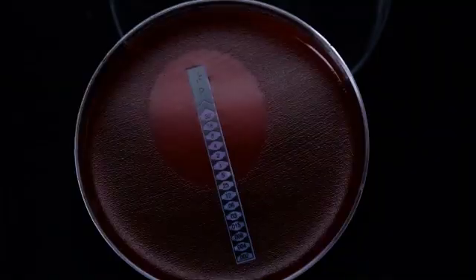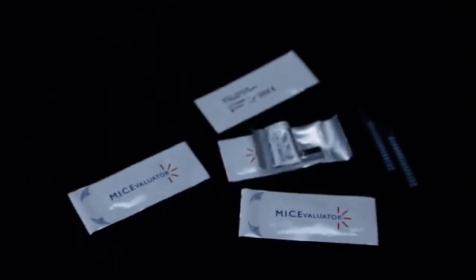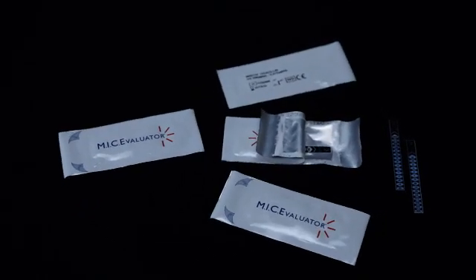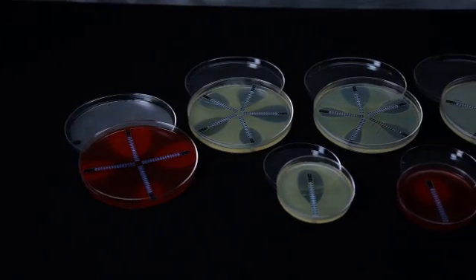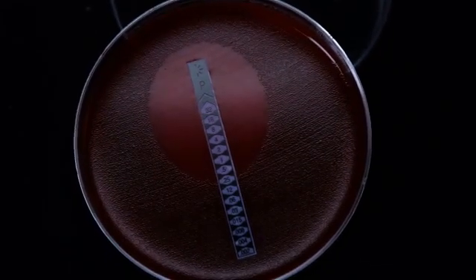After incubation, read the MICs where the growth of the organism touches the strip. If strips are being used for clinical purposes, only the white sections are used. If growth touches the black section, the MIC is read as the next section up. If half-step dilutions are required, read the white and black sections utilizing the reading guide.